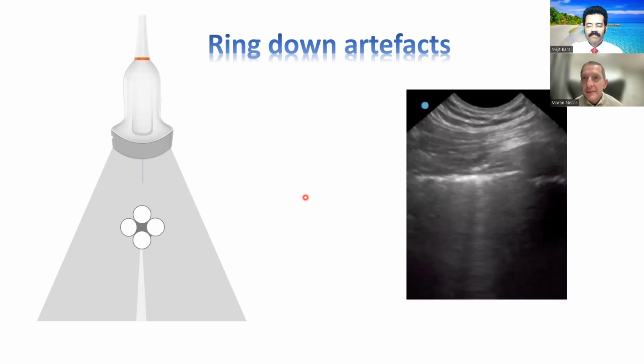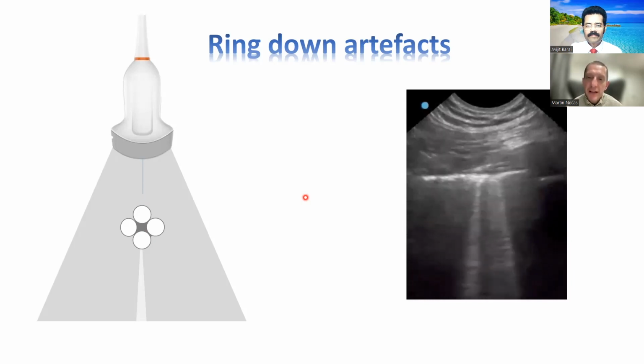And sometimes you have echogenic foci in the liver. It might be all sorts of things. It could be granuloma, it could be a calcification, or it could be gas. So the presence of ring down will tell you that it is definitely gas. Beautiful. Thank you for that.